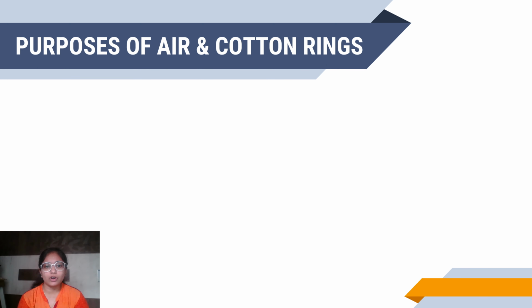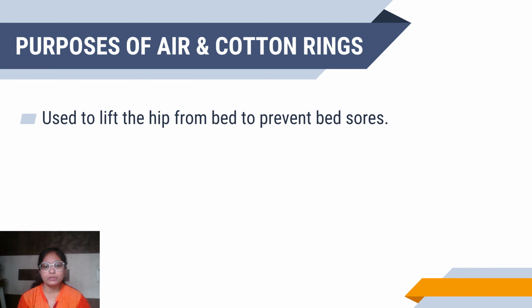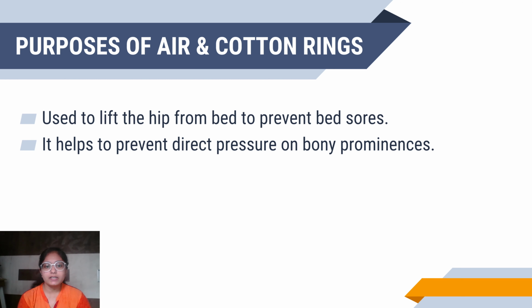Purposes of both air and cotton rings are: used to lift the hip from the bed for prevention of bed sores. They help to prevent direct pressure on bony prominences like heels, and help in improvement in circulation.